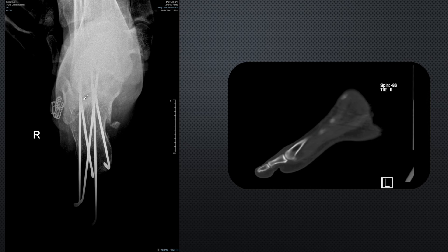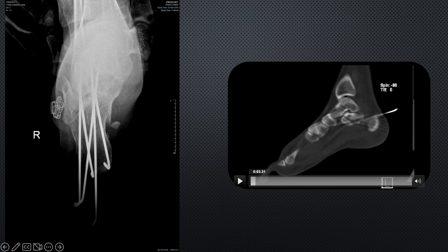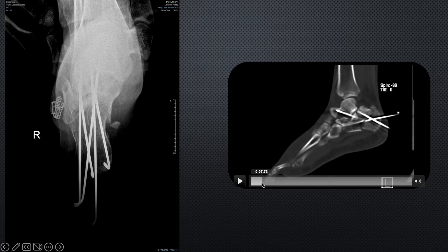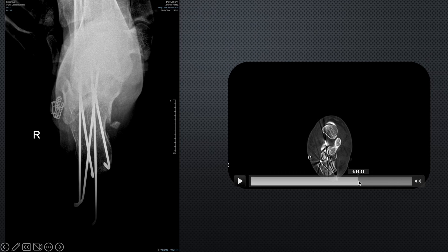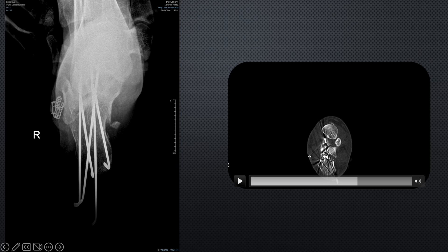This is the axial view — the posterior facet is quite visible and is almost parallel to the undersurface of the talus. We also ordered a post-operative CT for educational purposes. On the sagittal cut the undisplaced posterior facet is now realigned with the undersurface of the talus. In the axial CT view the medial part of the posterior facet attached to the sustentaculum tali is well reduced with the undersurface of the talus, and the previously displaced lateral part of the posterior facet is also reduced and aligned with the medial part. Both segments are now aligned and reduced. I hope this case presentation about this revision surgery will be helpful for improving your surgical skills. Thank you.